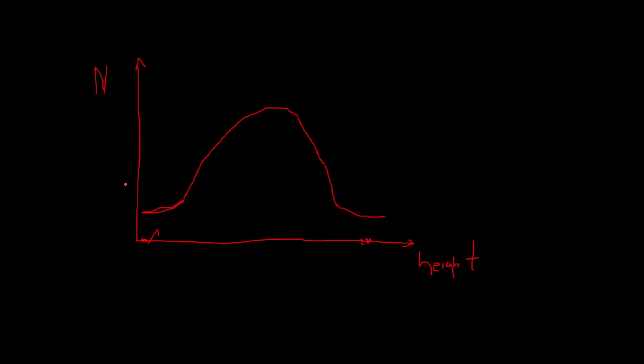Now, suppose if we were to actually calculate the area that is under this graph, let's say we go up to 20%. We'll go up to 20% here. So this will be a demarcation of 20% of the people. So let's draw a line here. So this area under the graph, or the length that is between the area under this graph here, you refer to that as your distribution width. So you have that as your distribution width of your height.